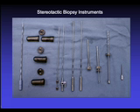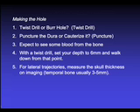Craniostomy traditionally was created through a standard 14 millimeter burr hole, but in recent years, most people use a small craniostomy, often with a 4 millimeter drill bit, as seen on the right side of this image. The standard array of stereotactic instruments include twist drill devices for puncturing the skin, small 4 millimeter or sometimes 6 millimeter drill bits, dural puncture needles, and sampling cannulae. Most people do use a twist drill. Most do not cauterize the dura, but simply puncture the dura itself.